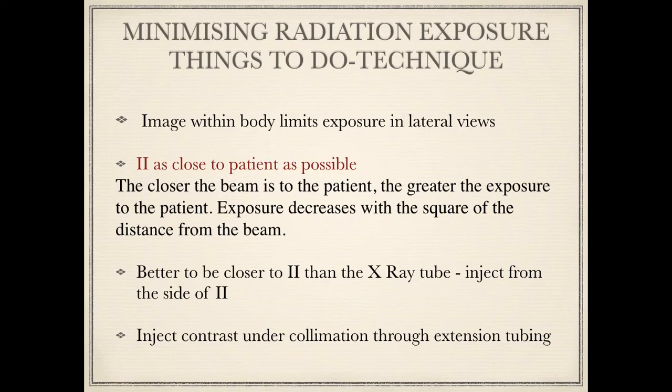Other simple things you can do to minimize your exposure, things like injecting contrast through an extension tubing, because then you have the option of being further away, and often when you're injecting through extension tubing, you're taking a continuous screen as well. So that is the time when you really want to be away from the machine as much as possible. So a simple extension tube can help you with this.